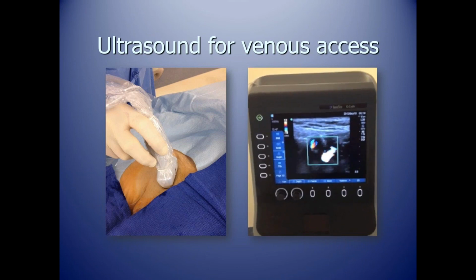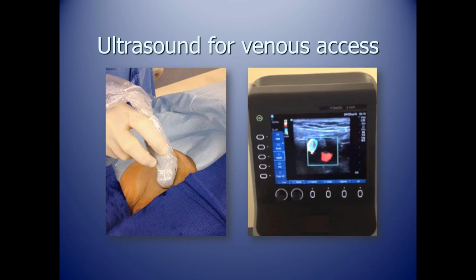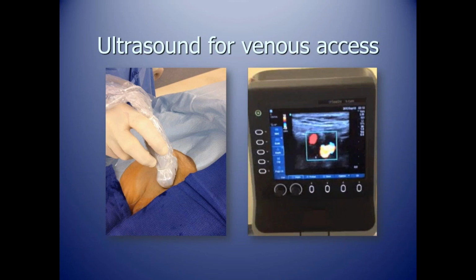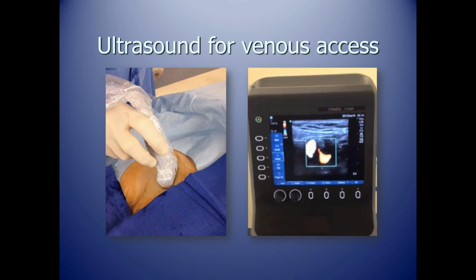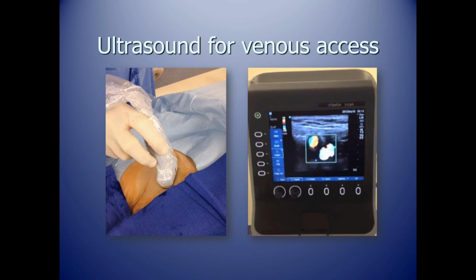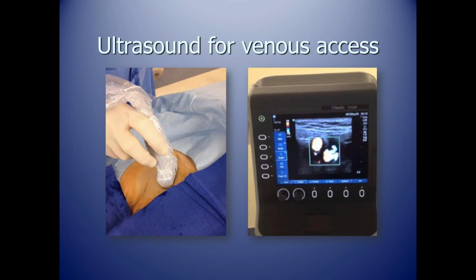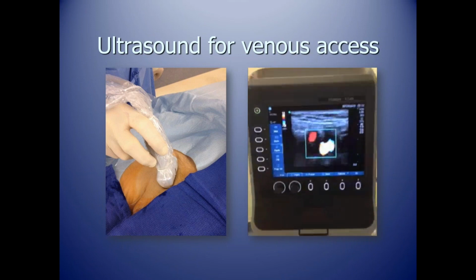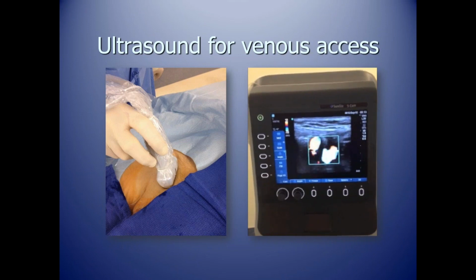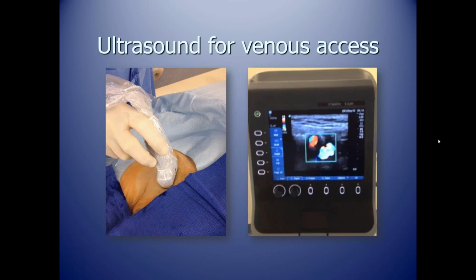But the point is that when we were participating in the Seattle 2 trial, a paper that came out after that trial really found that the more punctures, femoral or jugular, that one did, the higher the incidence of bleeding complications, or the lack of ultrasound guidance also was associated with bleeding complications. So basically, the bottom line is I implore you to use ultrasound for venous access, really as not an option.